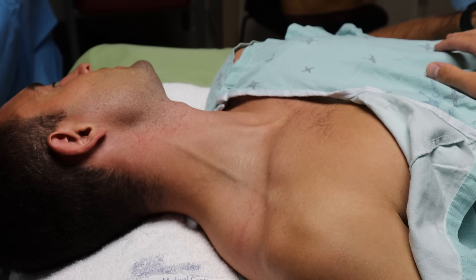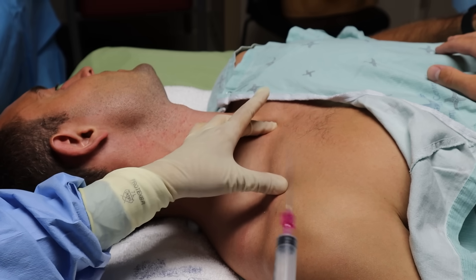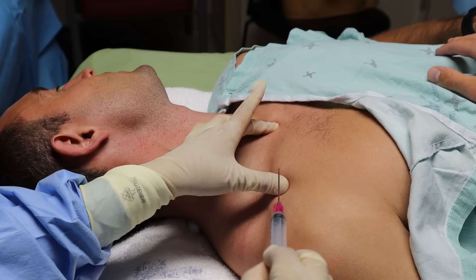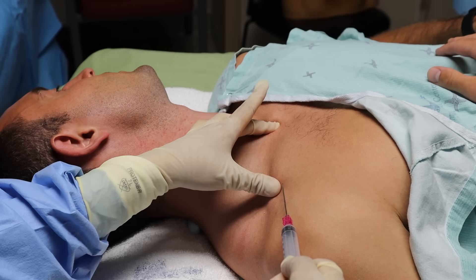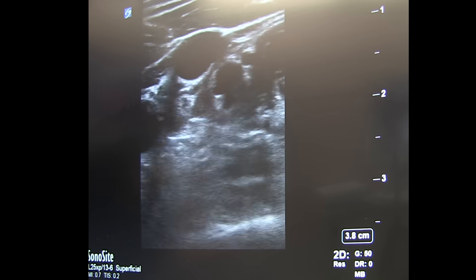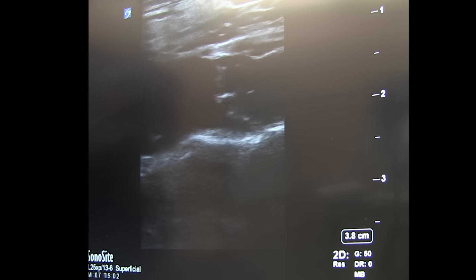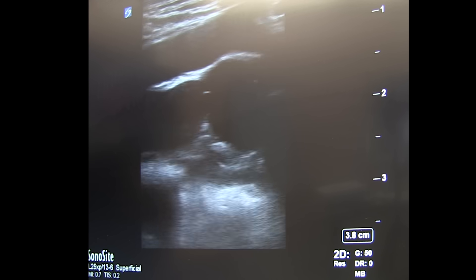For the blind landmark guided approach, put your index or third finger on the sternal notch, and then put your thumb on the prominent bump of the clavicle where it starts to bend toward the shoulder. Insert the needle next to your thumb and aim the needle at the finger on the sternal notch. Aspirate as you advance and you'll hit the vein. You can also get a supraclavicular approach by following the jugular down until it meets the subclavian, and then following the subclavian from there.